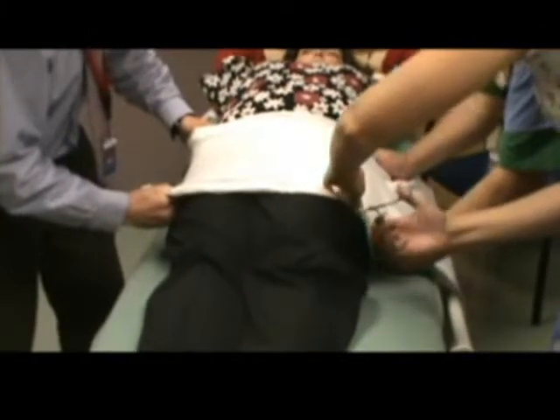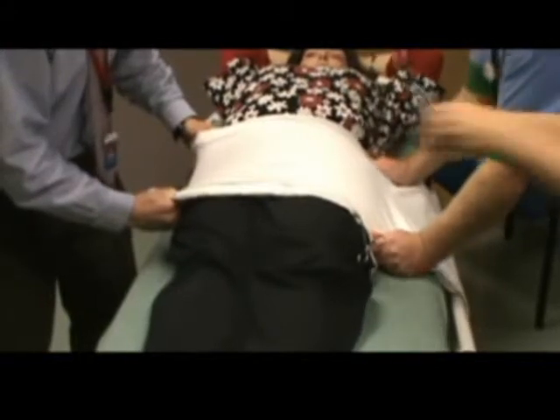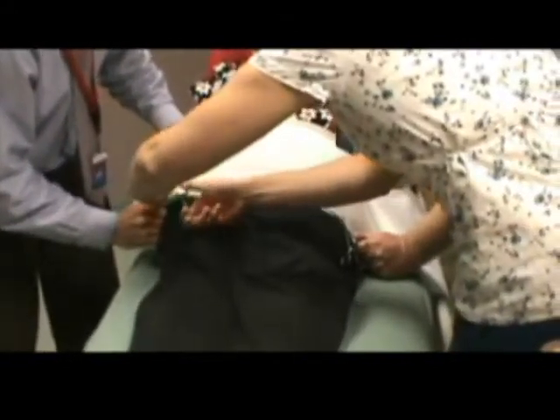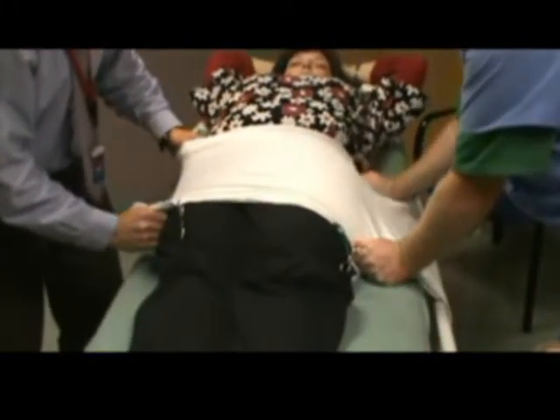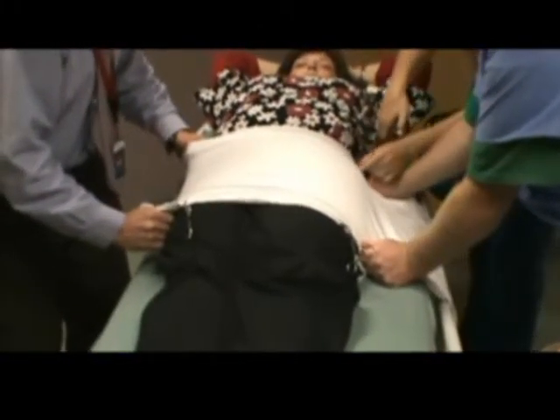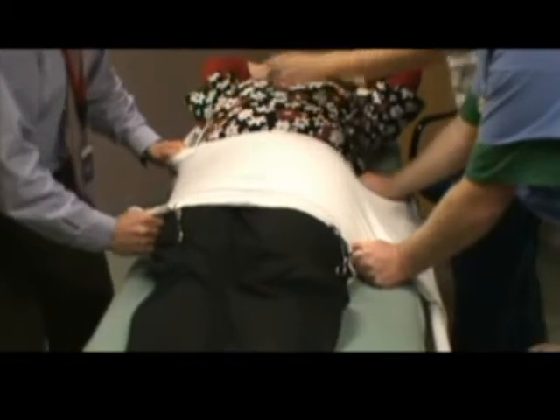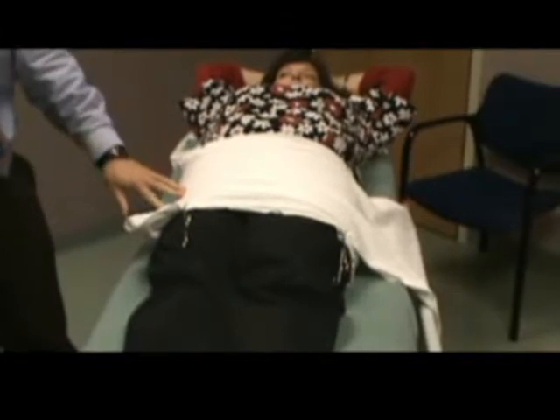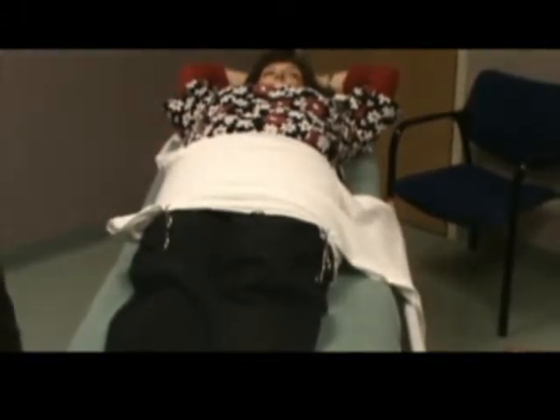We like to apply this using four clamps on each end, as opposed to tying it in a knot. We feel it provides more even compression across the pelvis and prevents any pressure sores that might come from the knot. By applying the clamps to the sides, it allows for x-ray evaluation. In addition, this sheet can be modified for access to the patient — cuts can be made on the sides for surgical intervention, or from the top for any type of access to the abdomen that's necessary.